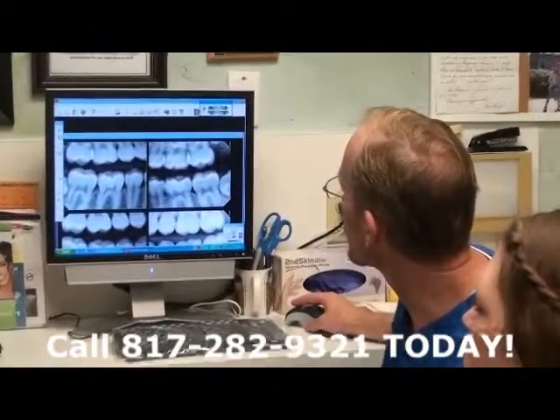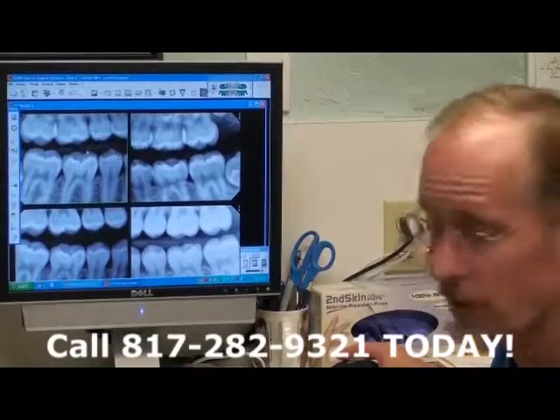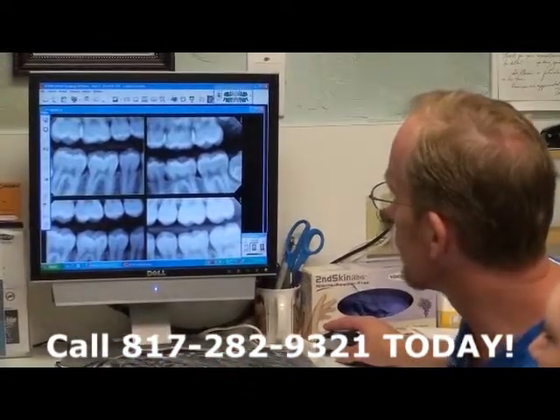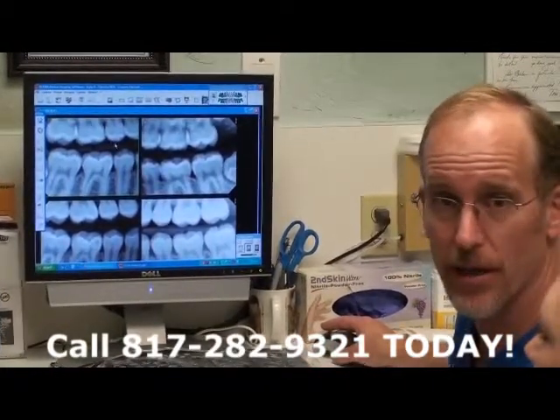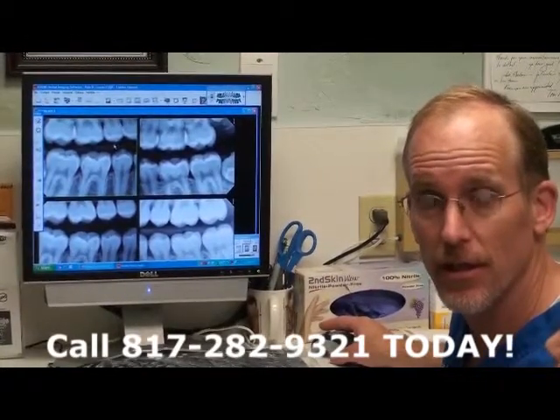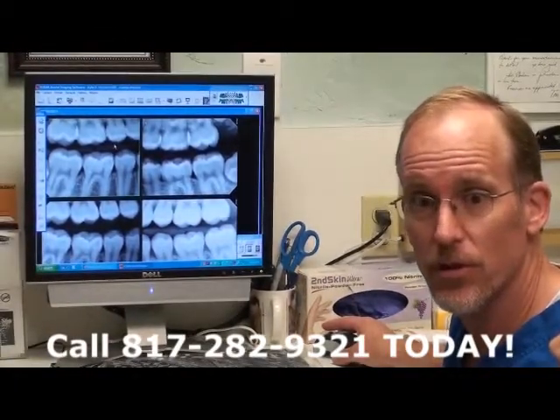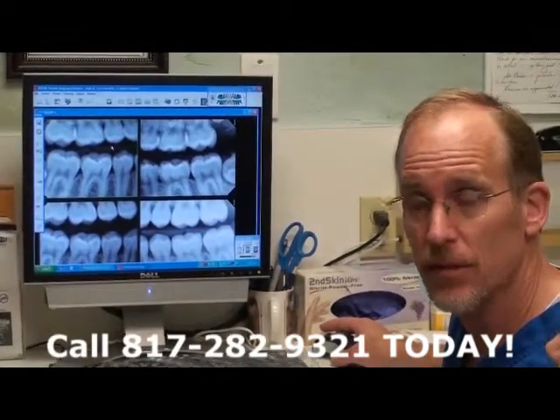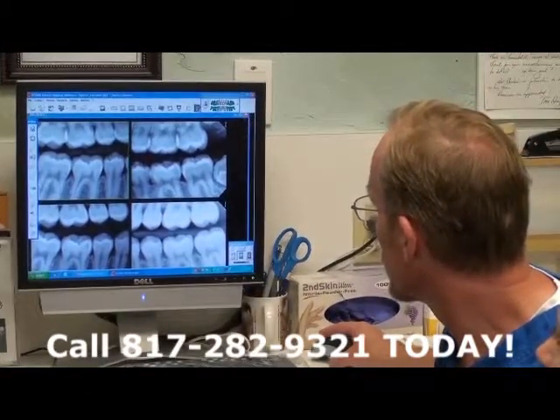When I look at her images, sometimes looking from further away is actually better, because you can see the image from a distance. You can see more contrast rather than having it so large. So that's what digital radiography does. It allows you to be a good diagnostician through good technology, and it lets you give better treatment to your patient. That way your patient feels more secure about what is being told to them, and about the treatment. So that's what technology in dentistry is doing today.